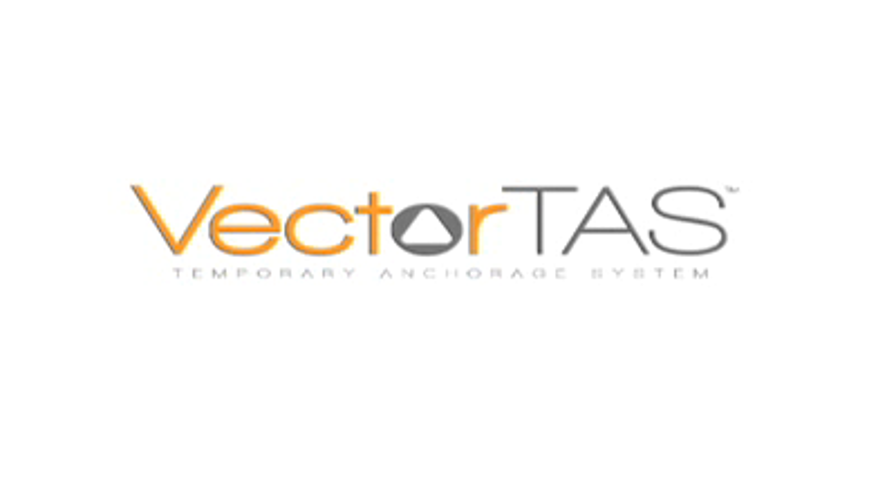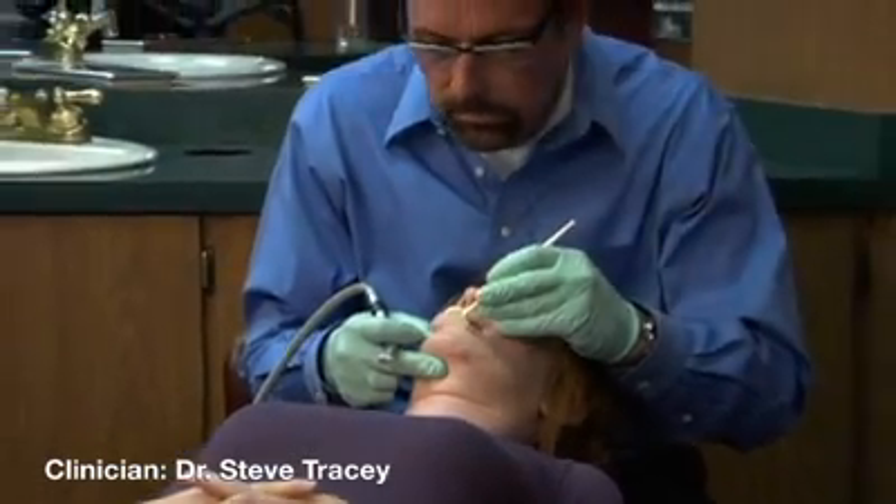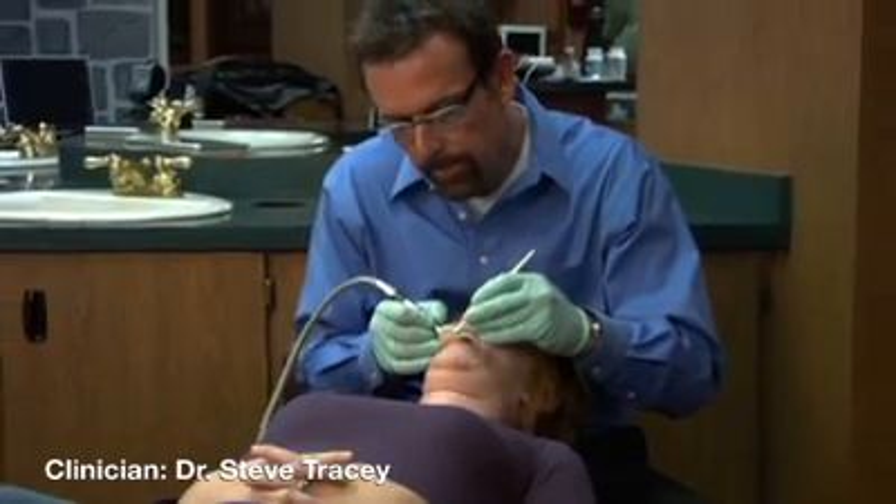Vector TAS provides you with a fast, effective means to treat a full range of orthodontic cases. In this occlusal cant case, Vector TAS dramatically simplifies treatment mechanics while providing greater control.